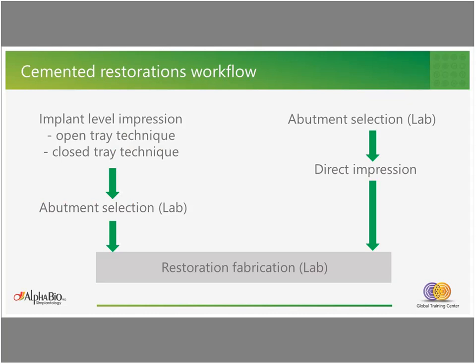The recommended workflow of cemented restoration, actually, we recommend that we take the impression from the implant level using the open or closed tray, and then we select the abutment on the working model. And actually, the lab can also make that easy for us, so it can be used as a much more reliable technique in making cemented restorations.